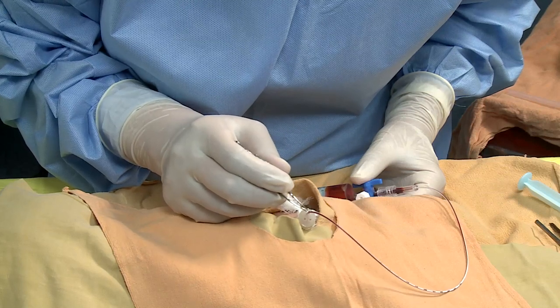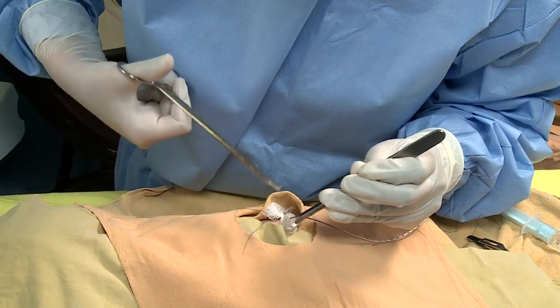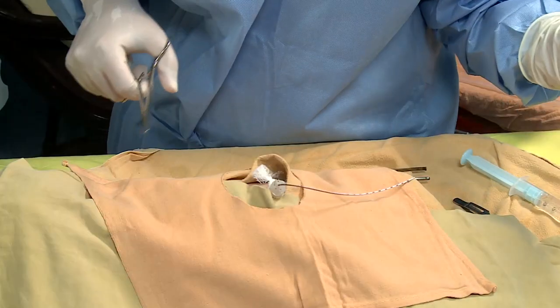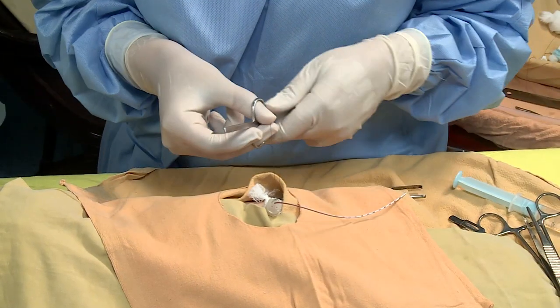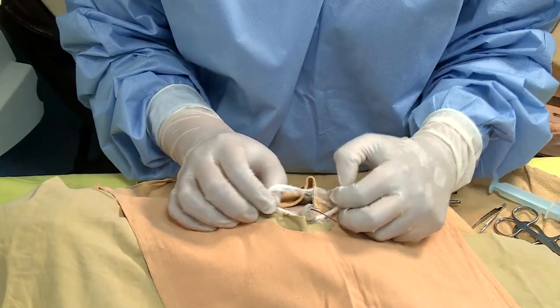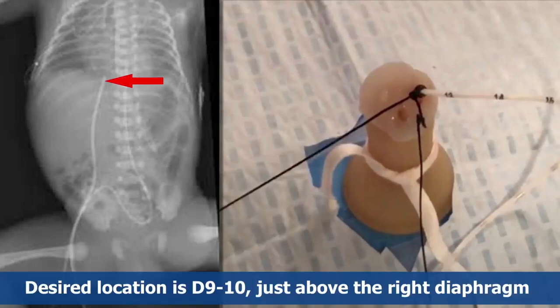Ensure free flow of blood. Place a purse-string suture around the base of the cord, avoiding skin or vessels. Remove the cord tie. Obtain an X-ray for catheter position verification. The desired location is D9 to D10, just above the right hemidiaphragm.